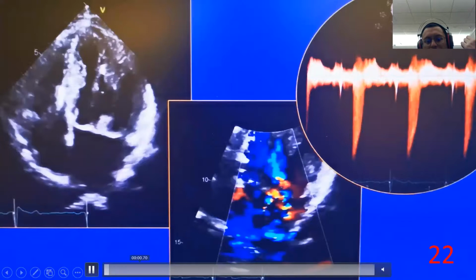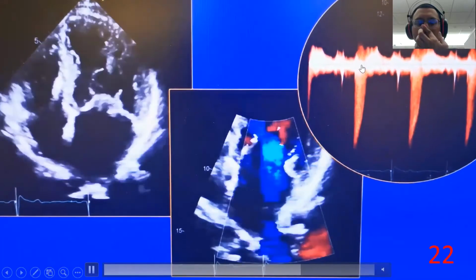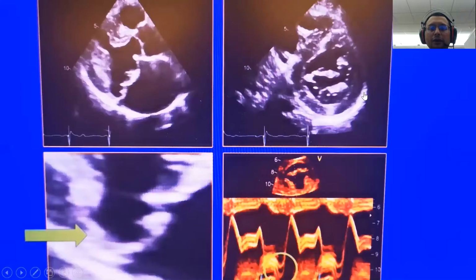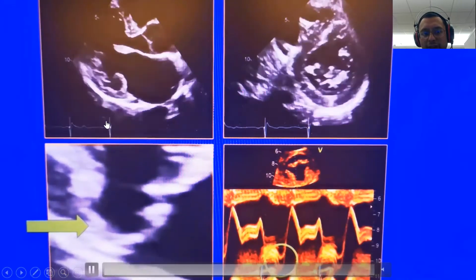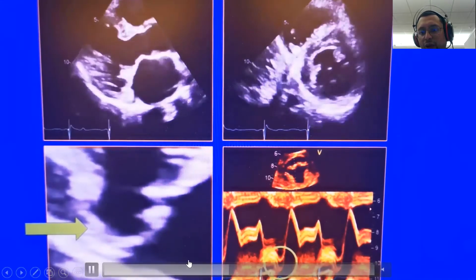Oh, okay. And you can see this late systolic Doppler that is typical of mitral valve prolapse. Late systolic click and murmur. Also in this patient you can see this moves suddenly, boom, moves suddenly, poof, because of the tugging of the mitral valve chordae.